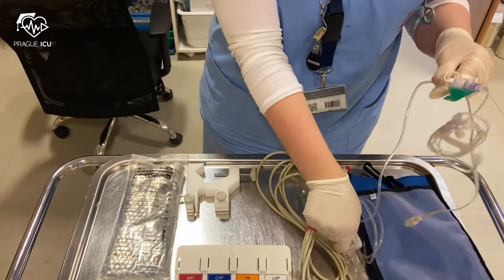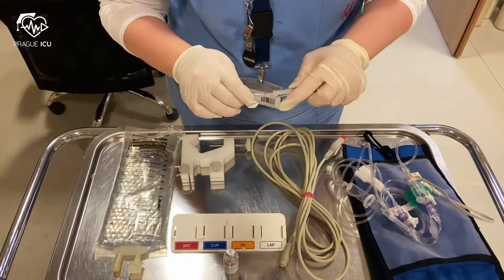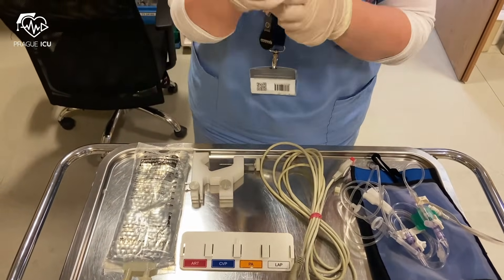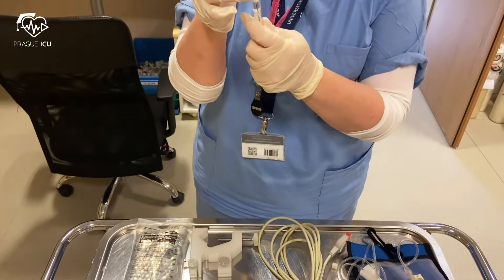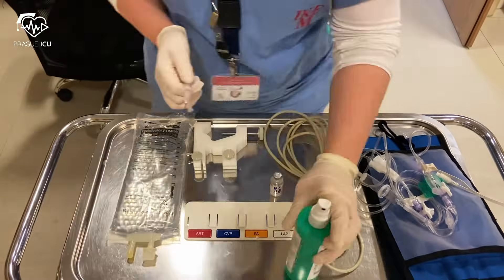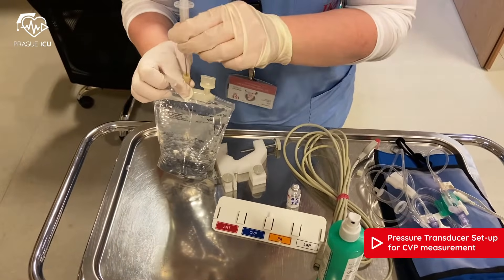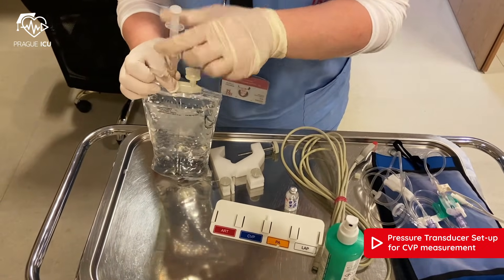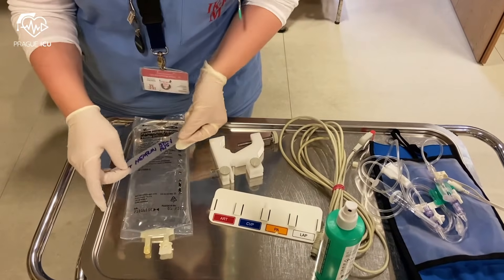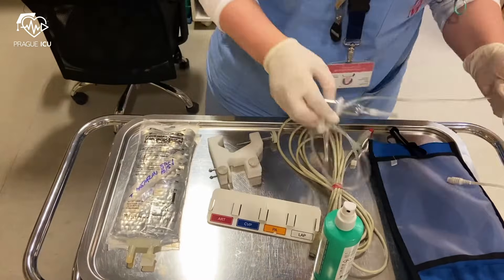First, you set up all your tubing which you will need for the IV line. Then you put 5000 units of heparin into the saline bag — in the video you can see it's one milliliter. You then label the bag with the name of the medication, date, and time.